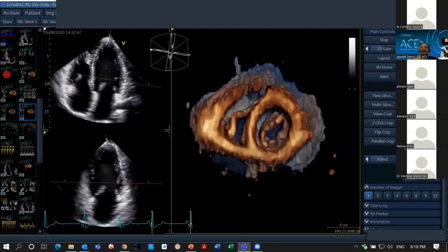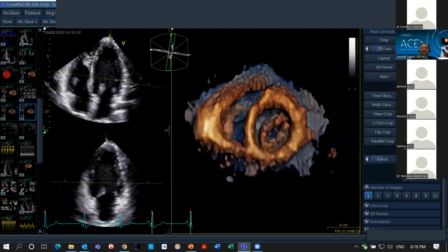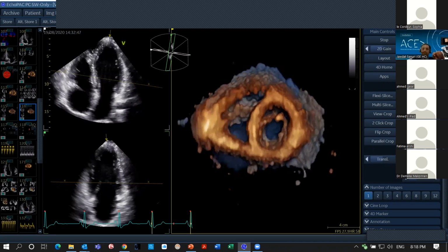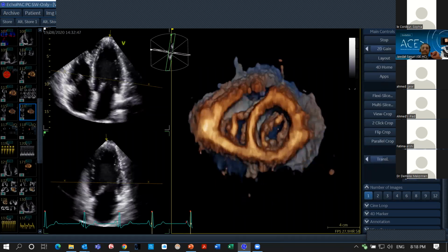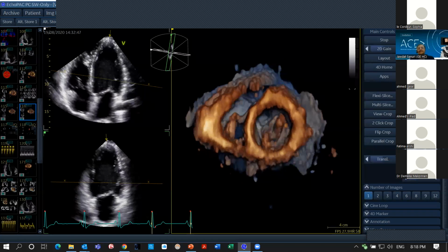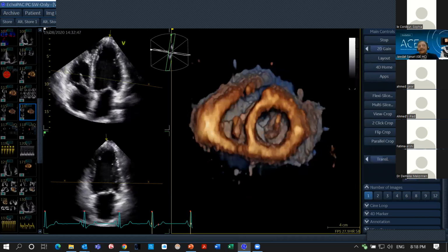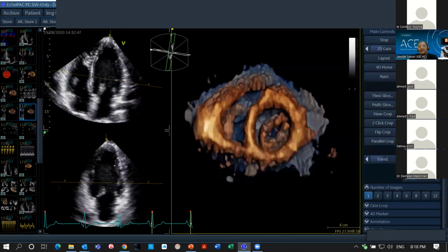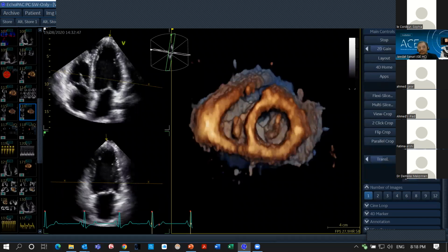I mean to do measurement on Tomtec. Yes. But they are sending raw data only. Yes, even on the Tomtec, because it uses the DICOM language. Any PACS network uses DICOM.